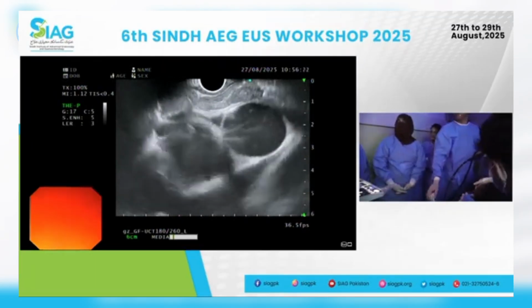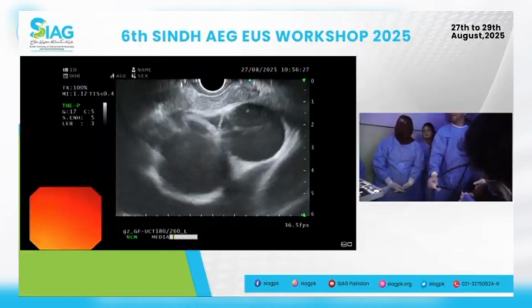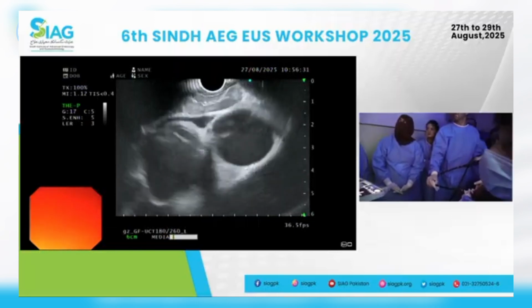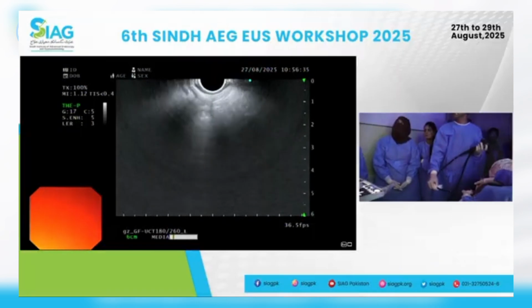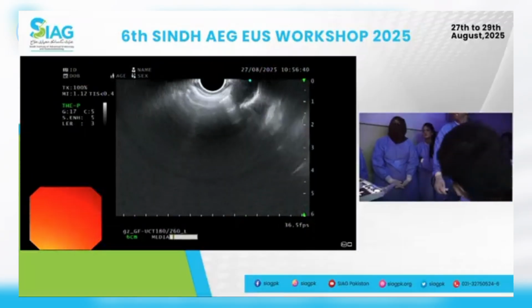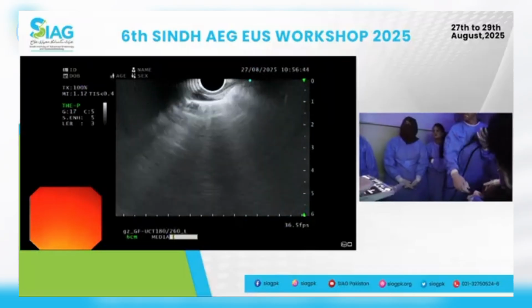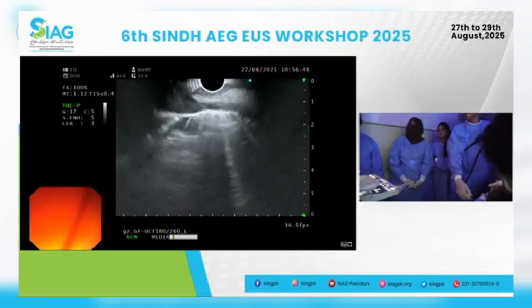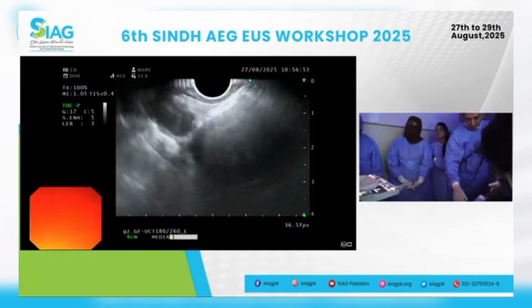Are we audible in the room? They're benign appearing, so I personally don't think we need to do the sampling. Let go, please. जाने दीजिएगा.